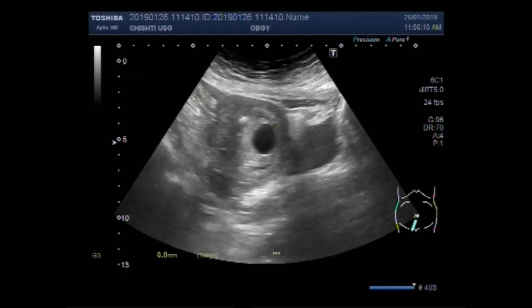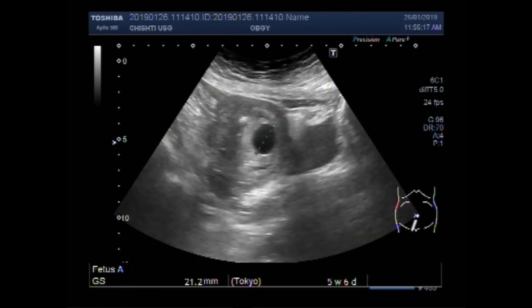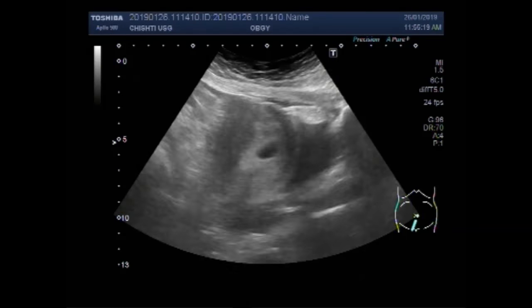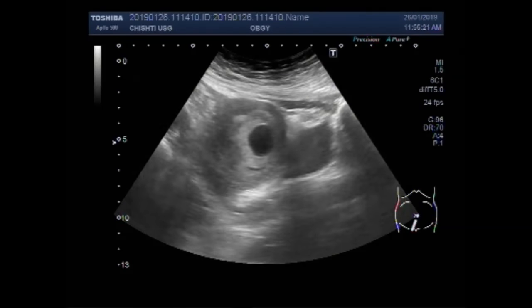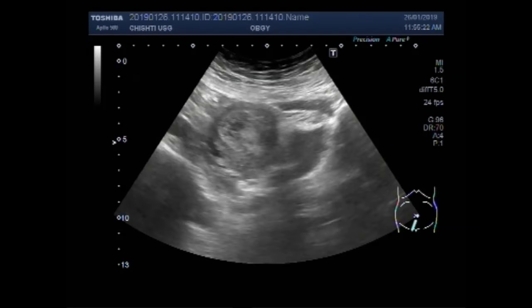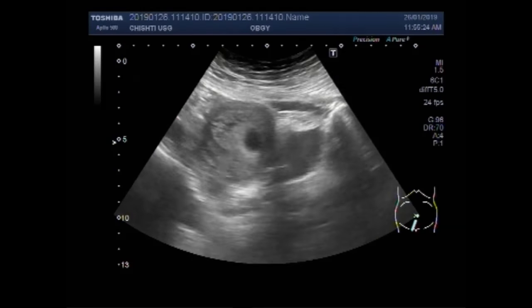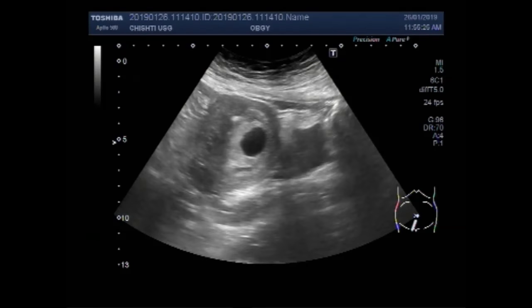In other words, the embryo fails to develop. You can see this is almost 6 weeks of pregnancy and there is no fetal pole in it.